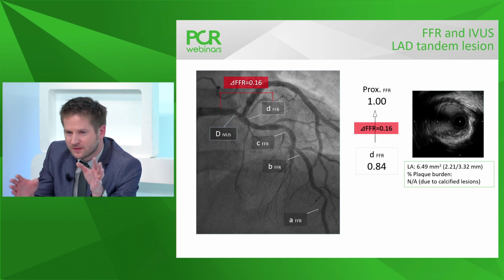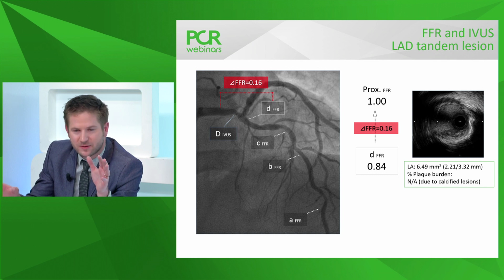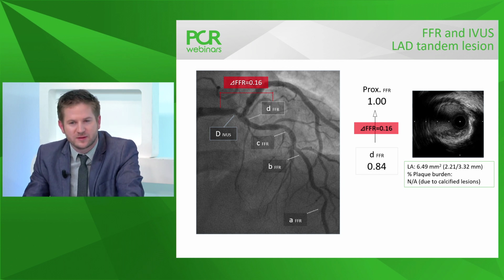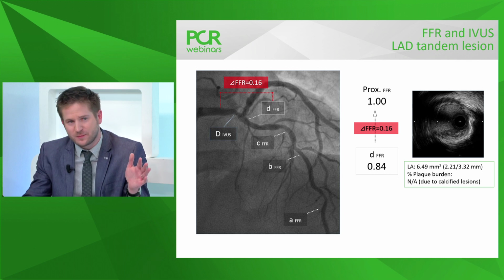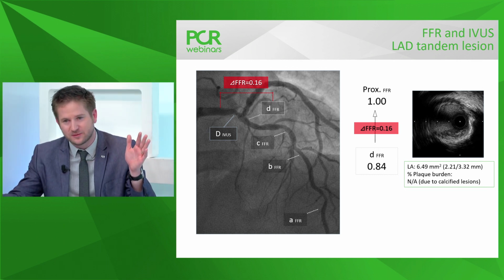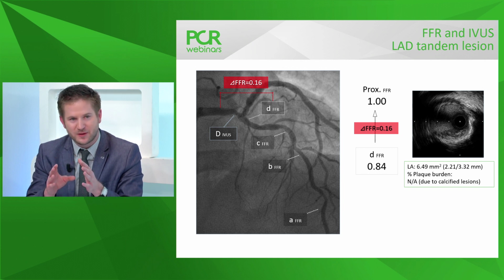But this discrepancy between the left main imaging measurement and the left main LAD functional measurement demonstrates nicely how the FFR measurement in the distal LAD gives you a kind of longitudinal understanding of the whole vessel, incorporating everything between the guiding and the sensor, while imaging gives you high quality information on the very spot where the imaging is located.